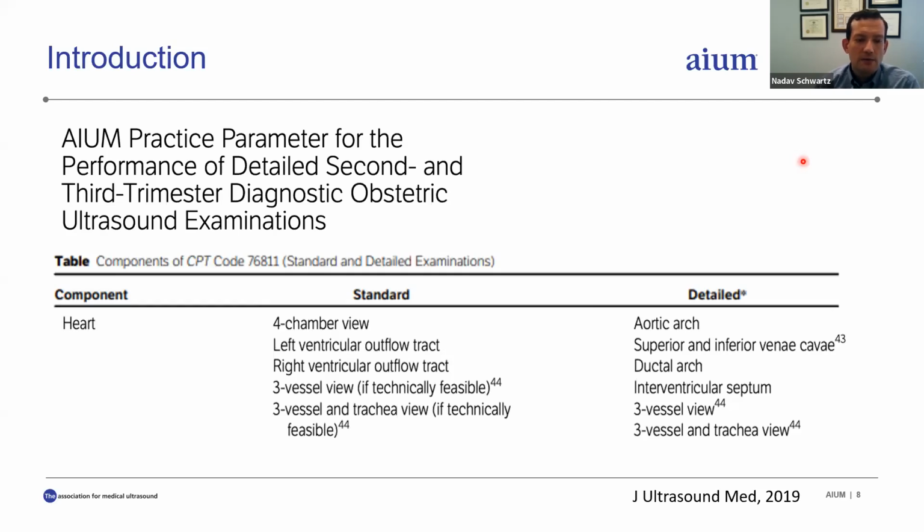Now, the issue is that sometimes the outflow tracts are a little bit more technically challenging to get. And in our opinion, the 3-vessel view and 3-vessel tracheal view really have a very, very pivotal role to play, even in the standard exam, as much as possible. So we're hoping to get you some comfort around that, understanding how to use it to really help you on as many scans as you can get them on.